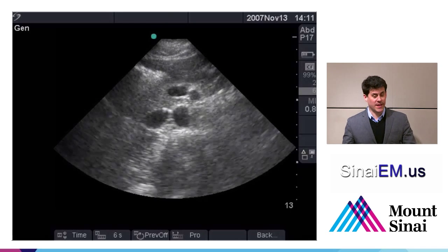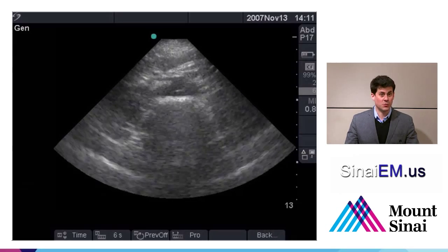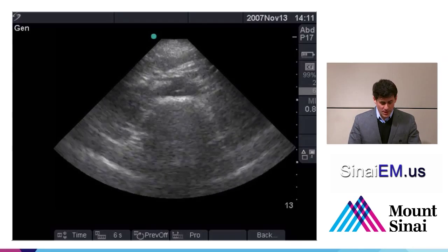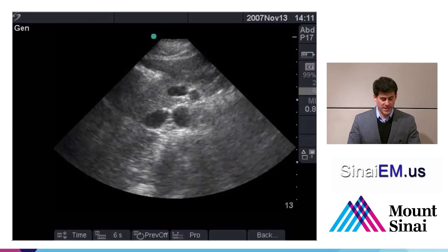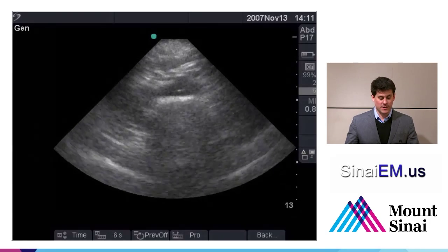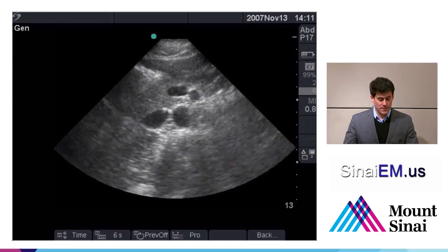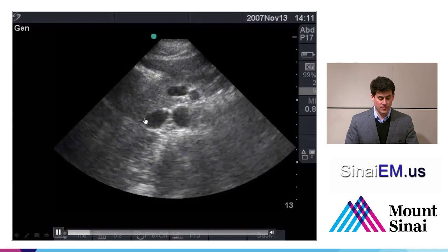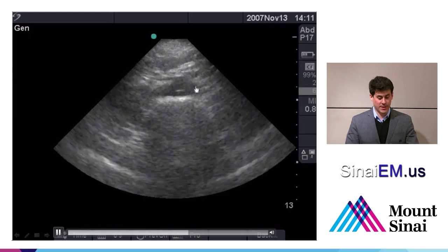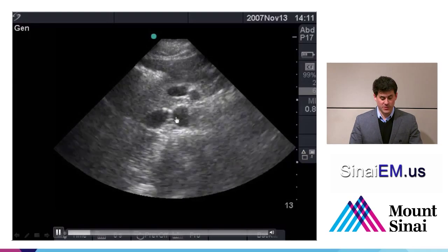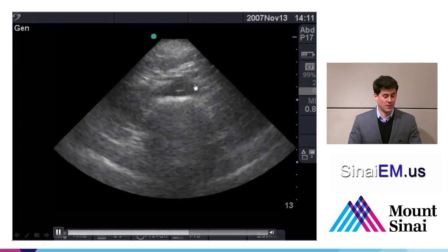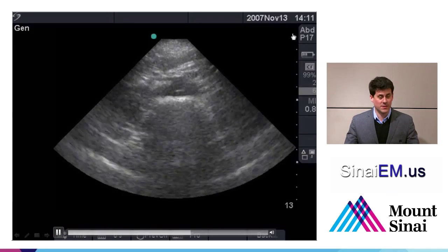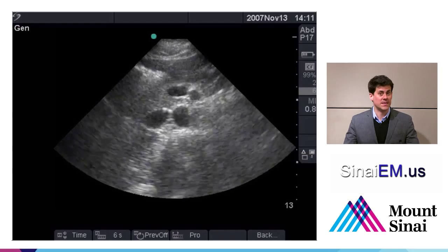Here's a real-time scan through a real patient, done with a phased array probe — demonstrating that decent images can be obtained with that probe in abdominal mode. Starting at the proximal aorta and scanning distally, you can see the iliac vessels bifurcating. Passing through again: we see the aorta, lose it briefly with bowel gas, then see the bifurcation. This doesn't have to take very much time — though not every patient's aorta can be visualized in four to five seconds, the exam can still be performed quickly.